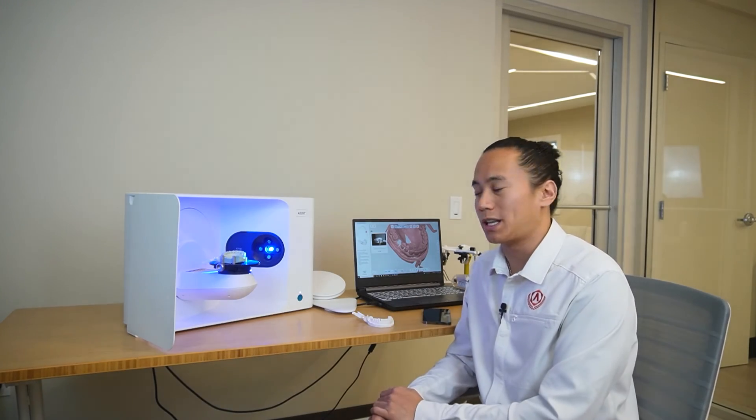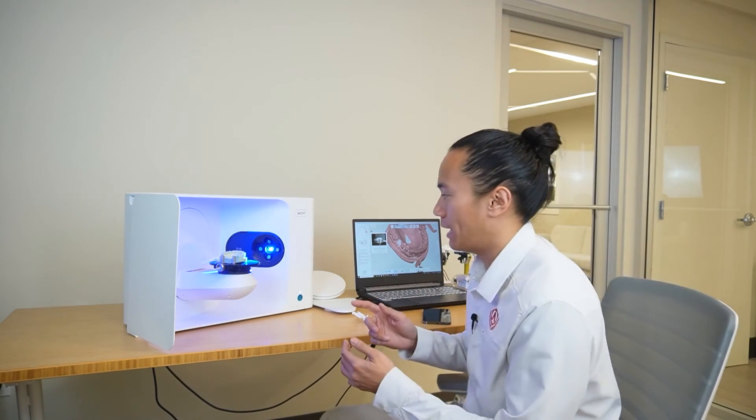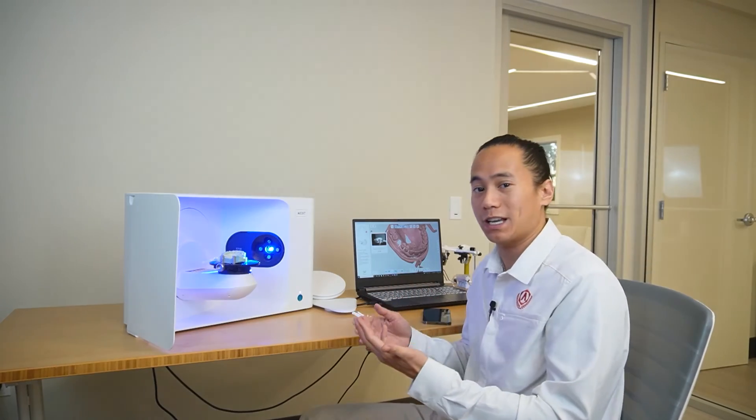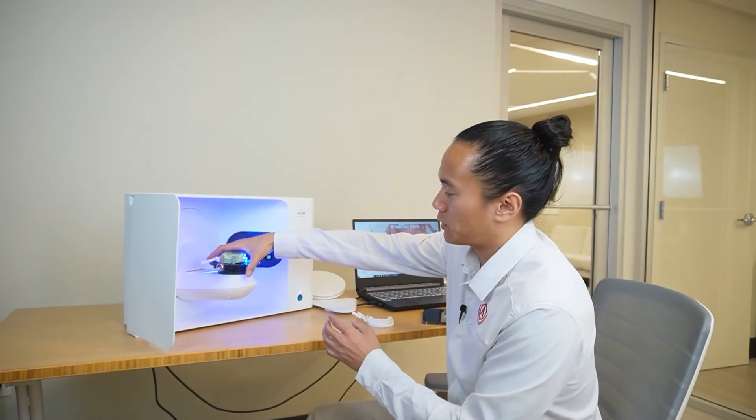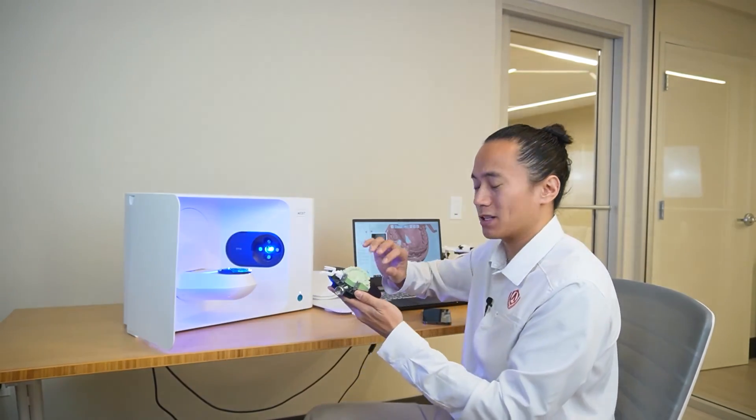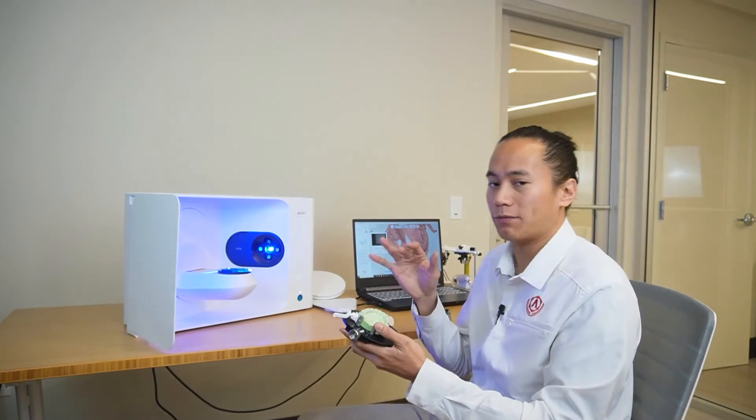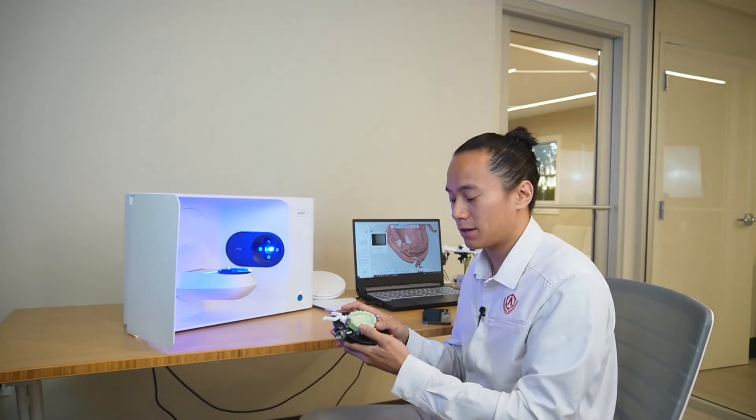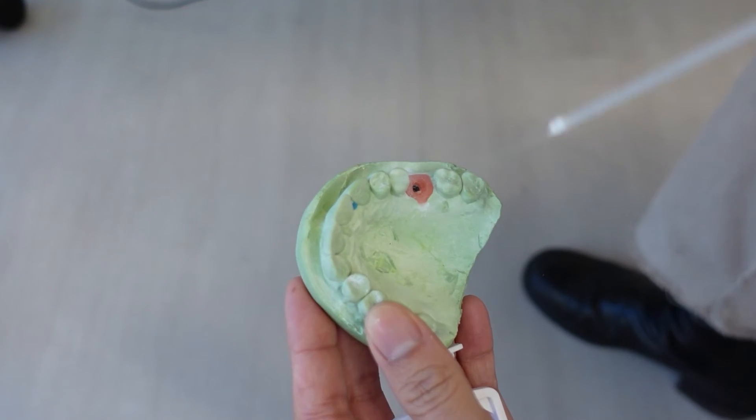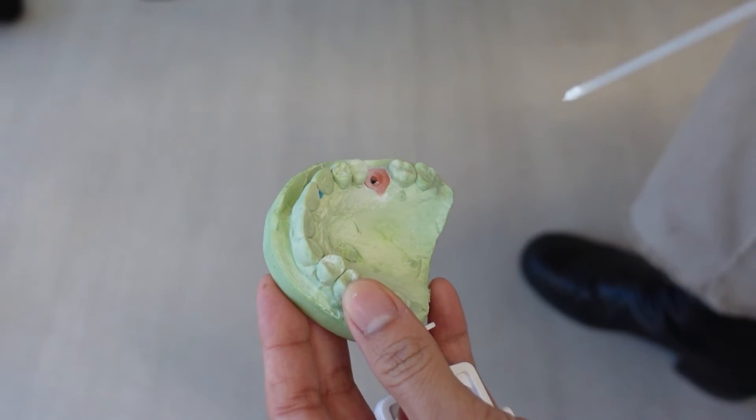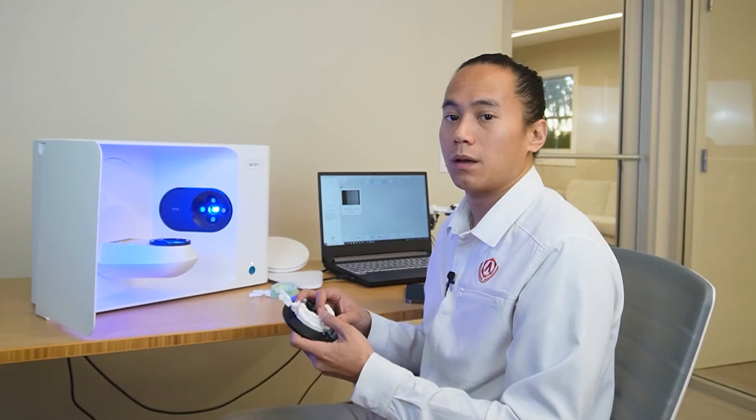Once your gingiva has finished scanning, go ahead and double check that you've been able to pick up all the data that you needed to. Sometimes when your gingiva mask is a little bit translucent or reflective, the scanner will have a hard time picking up all the fine details. So, you'll want to just add a little bit of CAD-CAN spray to your gingival mask and re-scan it from there.